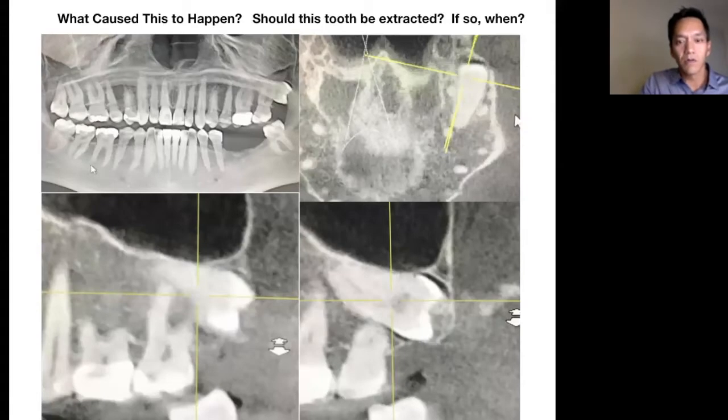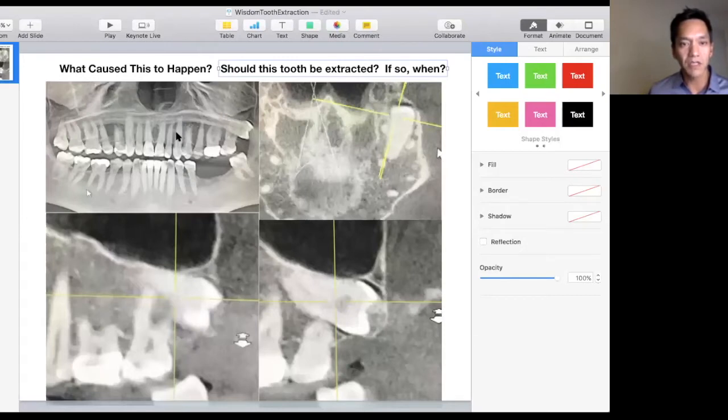All right. So what we're going to do is look on the upper left side right here. You can't see my face. All right, you can see right around here. This is the upper left side, as if you're looking at yourself. Right here is the tooth.